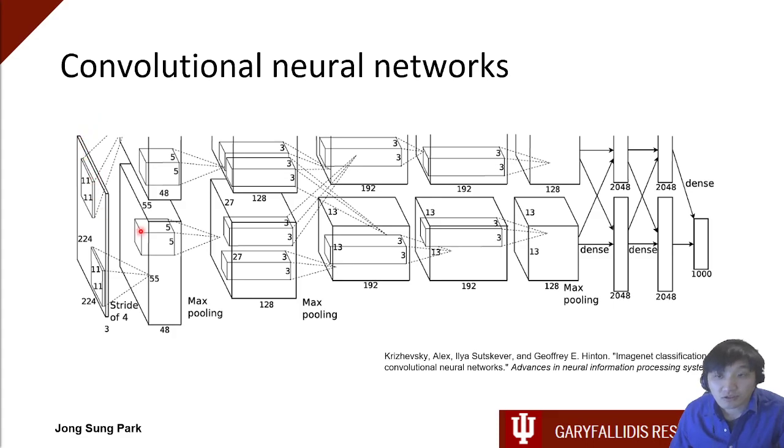However, on the convolutional layer, instead of just a linear relation with a weight, it would have a linear relation with a filter, a kernel. And this filter or kernel does feature extraction from the image. So what we're expecting the model to do is learn those important features of the image that will be important for minimizing our loss, so getting to our goal. In this case it would be classification, but we could just change a few layers at the end to easily make it a segmentation task.